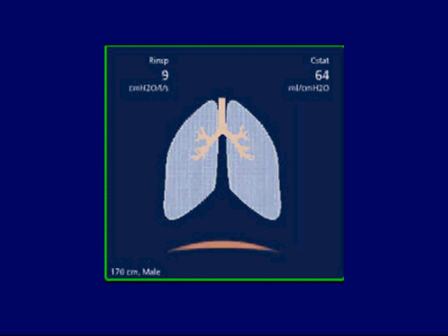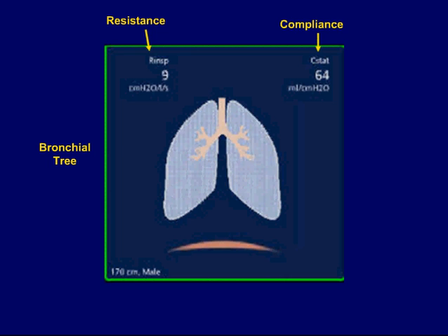The ventilation cockpit is broken down into two segments. One is the dynamic lung, and the dynamic lung allows the practitioner to see the patient's lung mechanics. It gives a visual representation — here's an example of the dynamic lung — and from the picture you can see it's broken down into the patient's resistance and compliance.